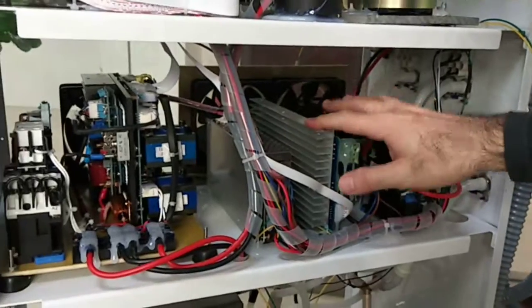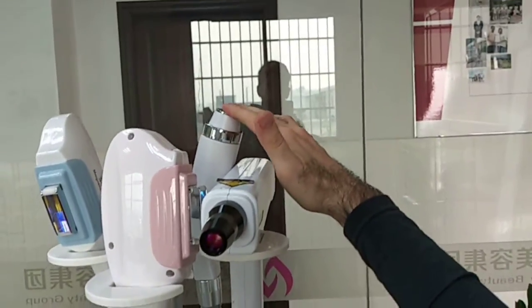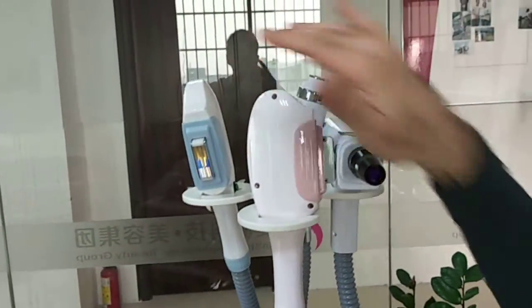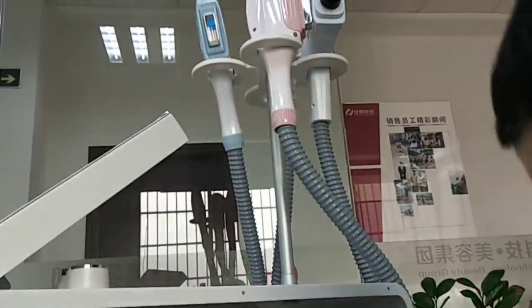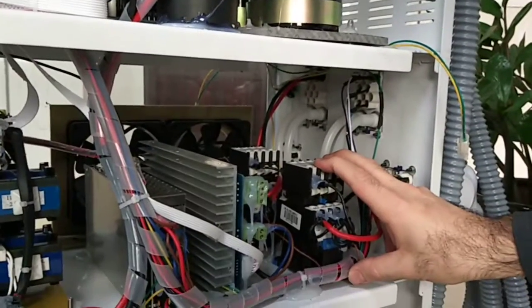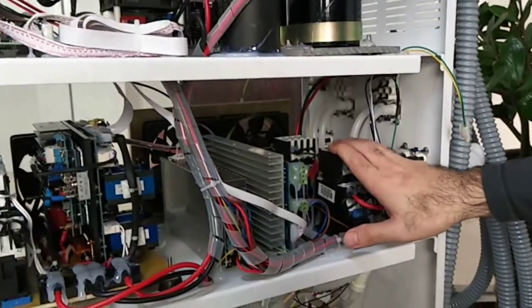As you can see, it's quite large, and there's a fan in there for ventilation. If we can actually go around, it's much easier. This one is the dedicated PCB for the RF, the radio frequency skin rejuvenation, which is this head here, which is cooled as well. So all 3 heads, 1, 2, and 3, are cooled. These are the 2 contactors for the two heads. With these 2 contactors, you can start operating when they're closed. Say for example, we close this one, then you operate this one. When you close this one, you operate that one. And this is automatic.